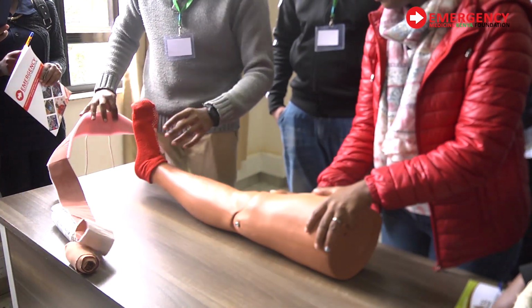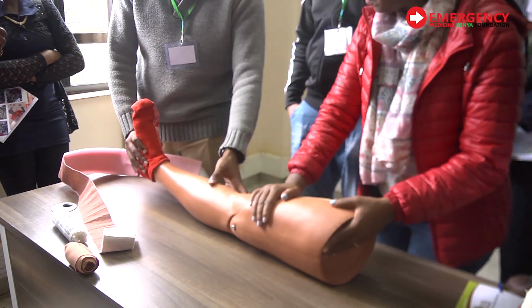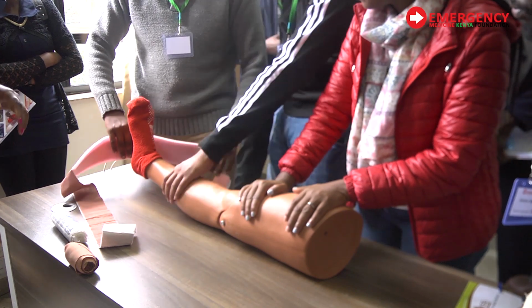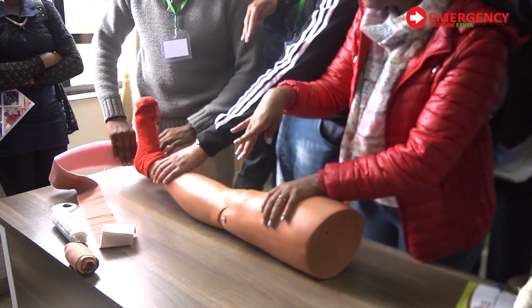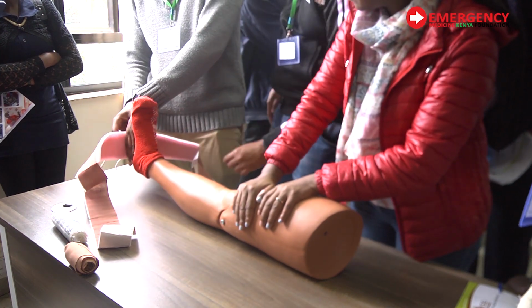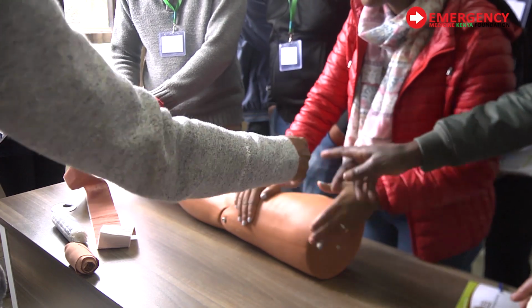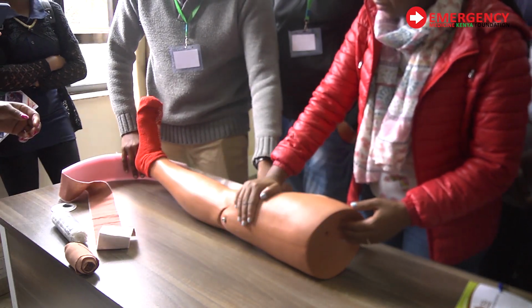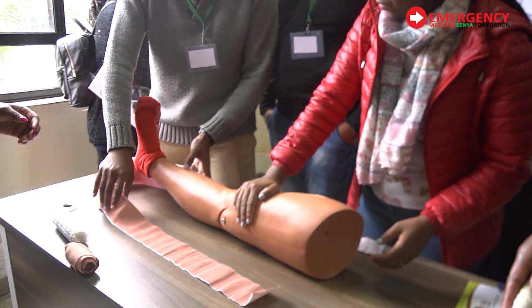Thomas splint. Chest tube, we did it a while ago. It was full. It was very full. So how many of you have not done chest tube? Let's just do a return demo, by the way. Another demo, so that at least you have fewer people and you can all see.